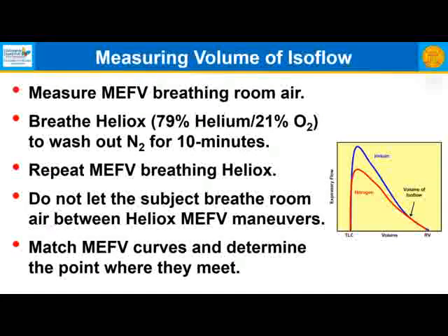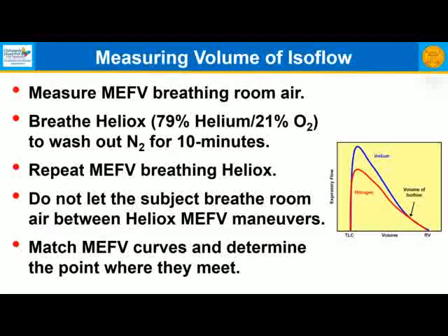So to measure this, we measure the maximum expiratory flow volume curve breathing room air, and then you breathe heliox, 79% helium, 21% oxygen, to wash nitrogen out of the lungs for 10 minutes. That's the standard. Then you repeat the maximum expiratory flow volume curve breathing heliox. Do not let the subject breathe room air between heliox maximum expiratory flow volume maneuvers, and then you match the curves to determine the curve where they meet.